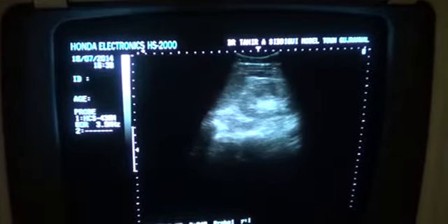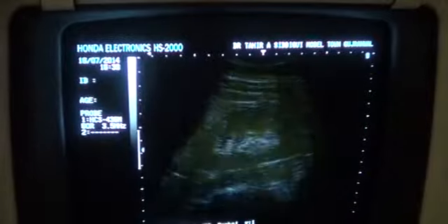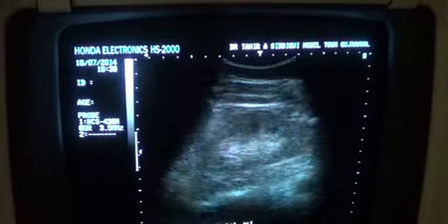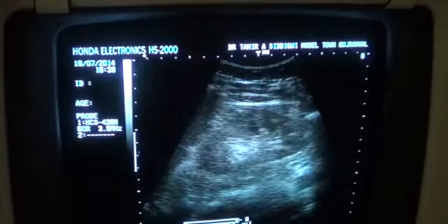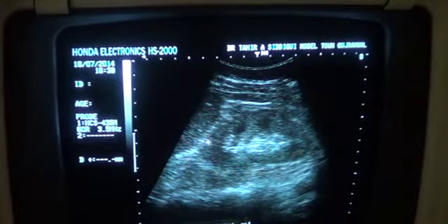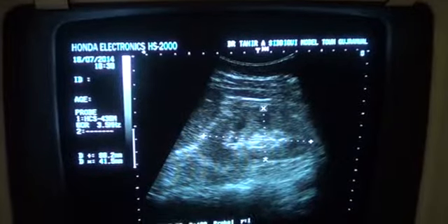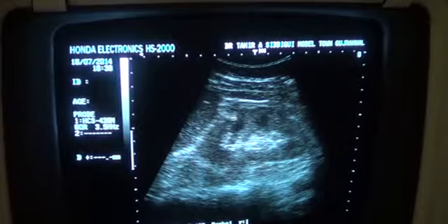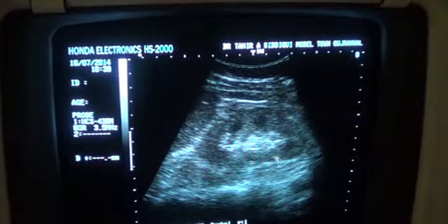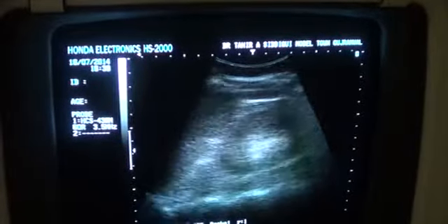Now see the left kidney. Left kidney shows all the same findings as we saw in the right kidney. You can see that there is diffuse raised parenchymal echogenicity, there is prominence of the pyramids, and there is muffling of the central sinus echo complex, and it measures approximately 8.6 by 4.1 centimeters. The dimensions are normal, but again the echogenicity of this kidney is raised more than expected normal. So both kidneys are showing grade 1 renal parenchymal changes.